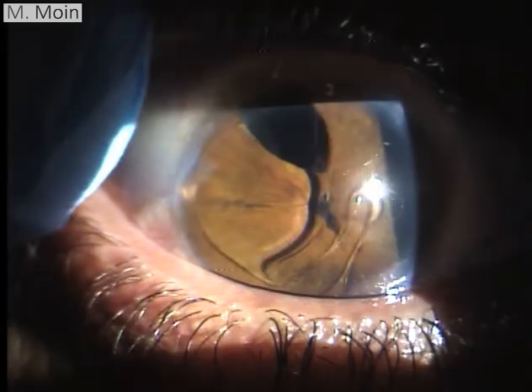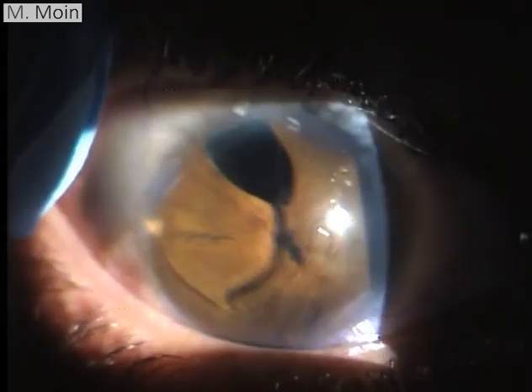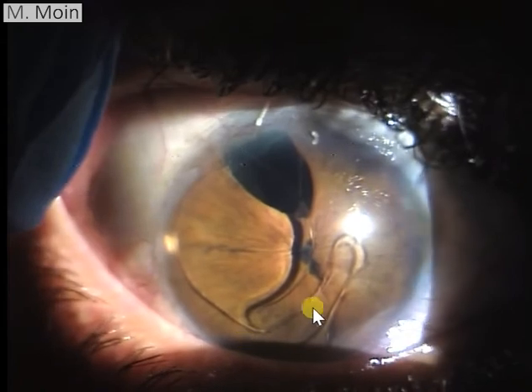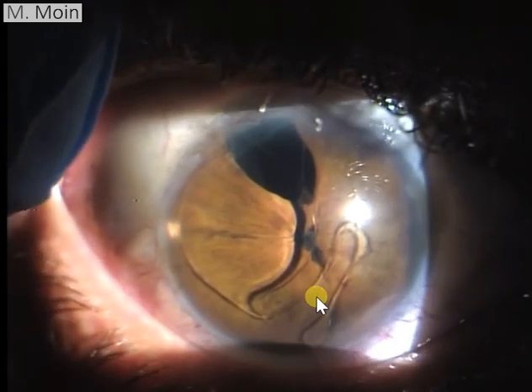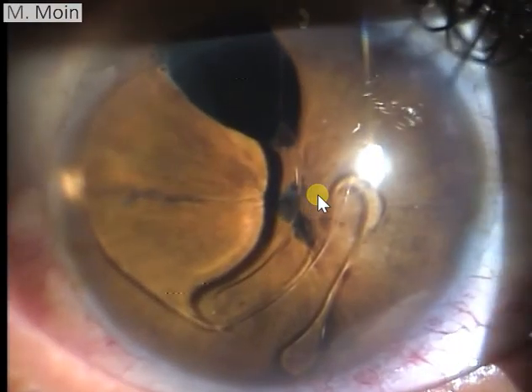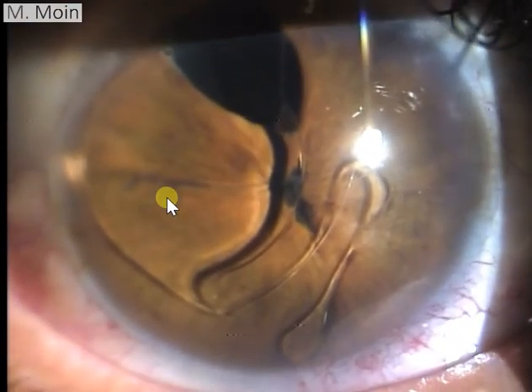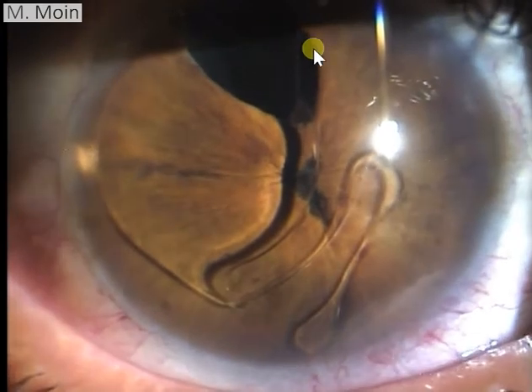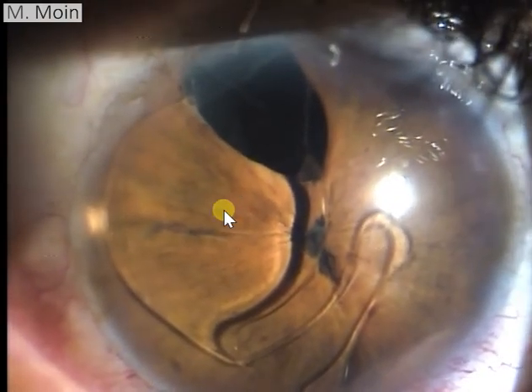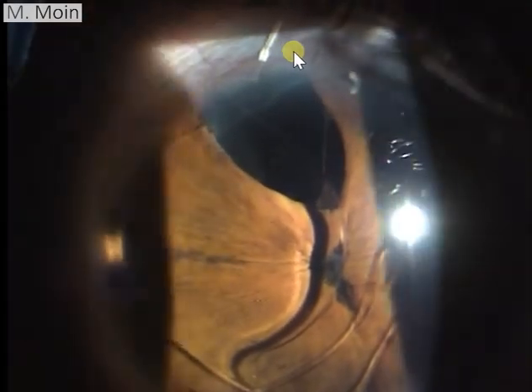Let's see with the slit lamp. The next thing which you're going to see is the intraocular lens. The other thing which you want to see is there is iridodonesis. When the eye moves, you will see the iris shake, and this is the area where the pupil has been myosed. Superiorly there is an area which is broad, which is a superior iridectomy, present over there. And this is the area of the limbal wound over here.